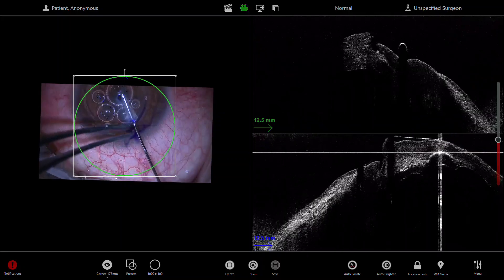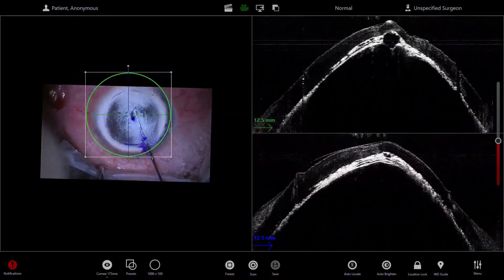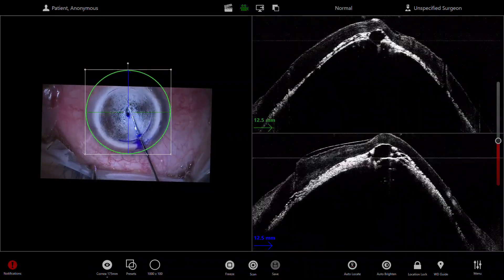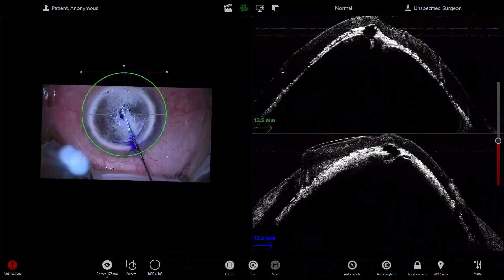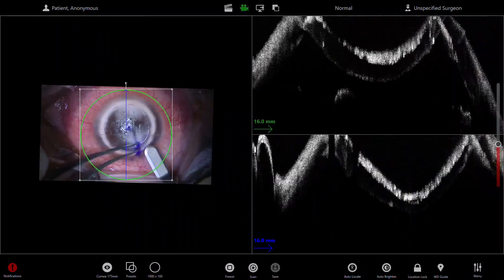I'm gently but firmly injecting air in a steady stream, and you can see the big bubble here very nicely. On the OCT you can also see the cannula, and you can see that the big bubble has been achieved with the OCT guidance.